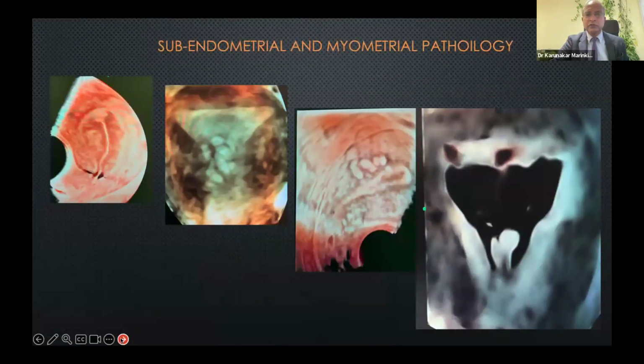I showed this slide before. You can see the pinching of endometrium into the myometrium. So this is adenomyosis. I'm moving slowly into myometrial adenomyosis. As you can see in the AP view, you won't get a good view. In the right sagittal view, you can see endometrium growing into the myometrium, and you can see subendometrial polypoidal changes. It can be just an adenomyotic focus.